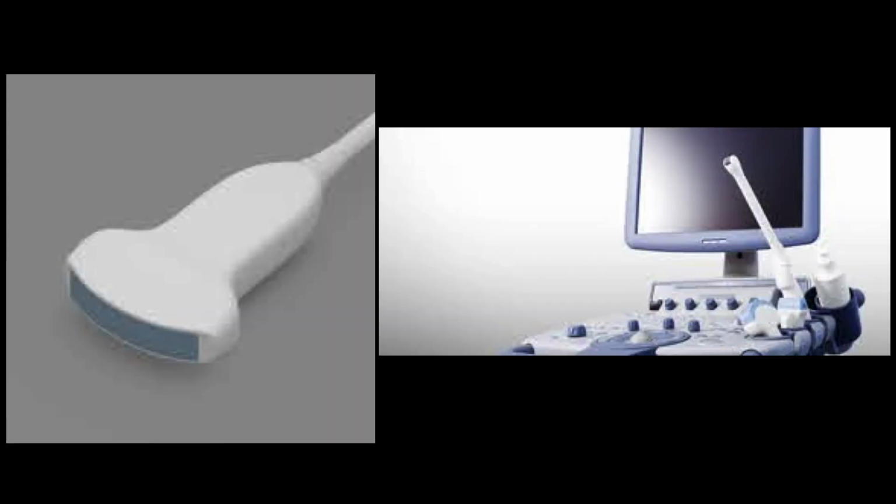Using your machine to your advantage will improve your images. Using different harmonics will improve your image quality. Also, make sure your focus is always at or just below the organ you are imaging. Always consistently adjust machine controls for each image. Don't just set your controls and go through the scan. Use the heel-toe method to make things horizontal on your screen.